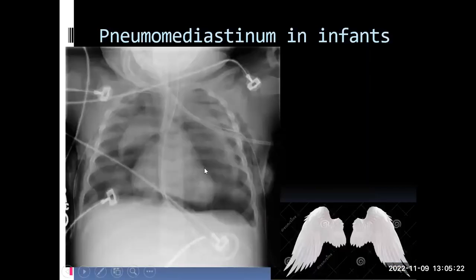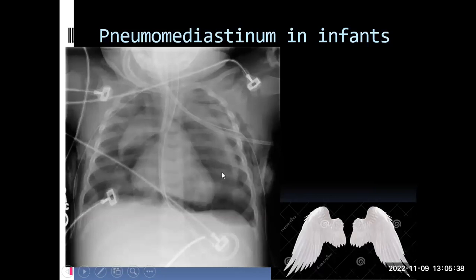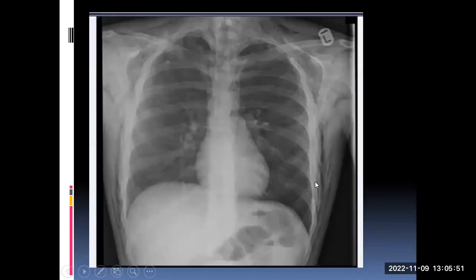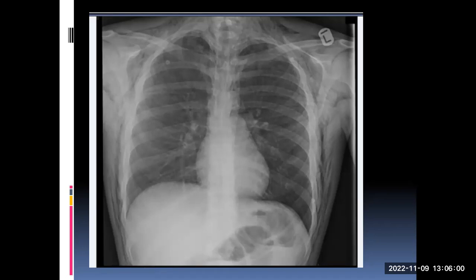Pneumomediastinum in little infants has a special appearance because of the thymus. The thymus gland is outlined and lifted up by the air, just like angel's wings — so we call this the angel wings sign. We always have nice names and signs because we tend to forget otherwise. Outside the thoracic cavity, you can have surgical emphysema, also called subcutaneous emphysema — all house officers must have seen these in day-to-day practice. In this patient there is concurrent pneumomediastinum as well.